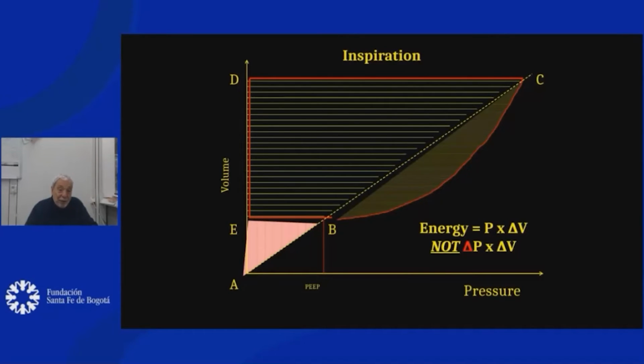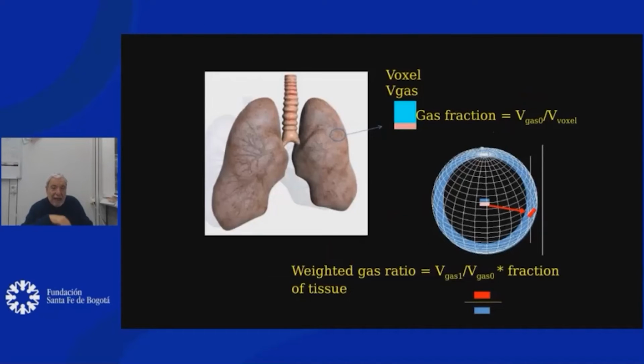Remember, what is important is the pressure, the absolute values of pressure, not the change in pressure for the changes in tidal volume. Pressure times the tidal volume is the energy. And then we have another possible cause of damage: the distribution of stress and strain.